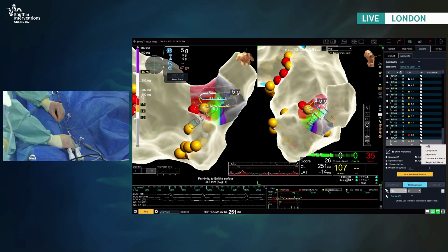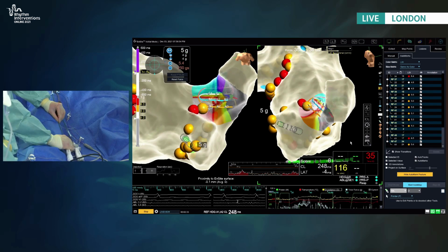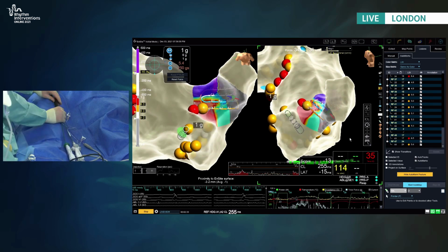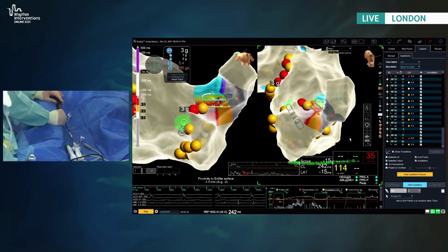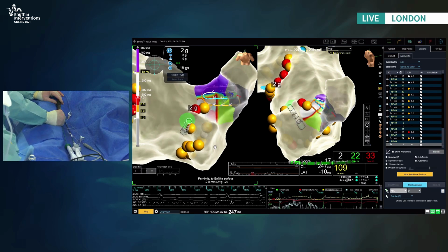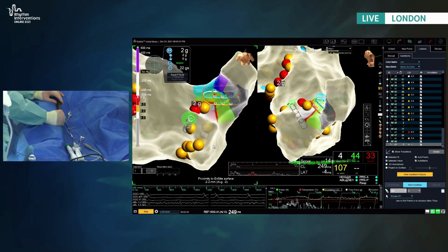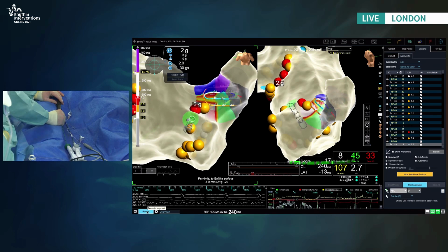If you ablate early in AFib with small atria, patients are going to do well. And we all know once you have an 8-centimeter atrium full of scar, you can do whatever you want. It's not going to work. And so I think the whole key is going to be getting to them early, before you get all this substrate remodeling, where I don't want to say it's hopeless, but is the effort worth the results? I think that's yet to be determined.